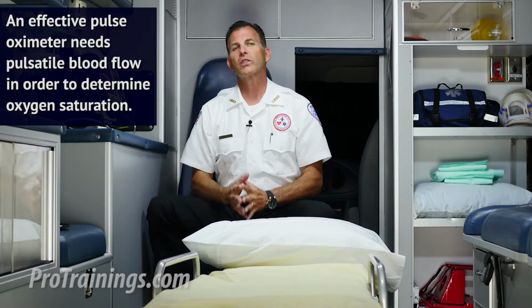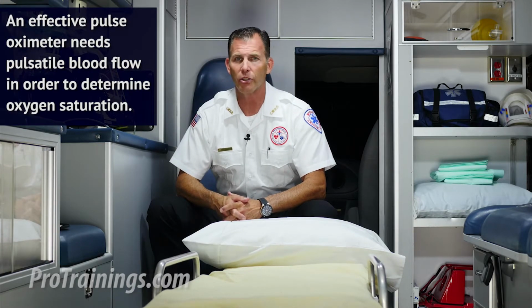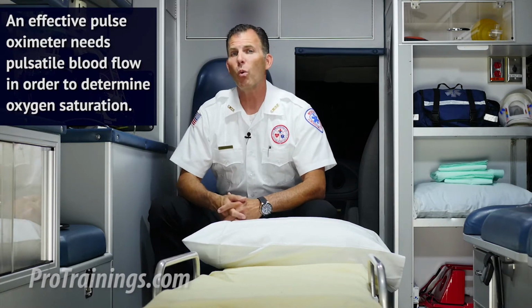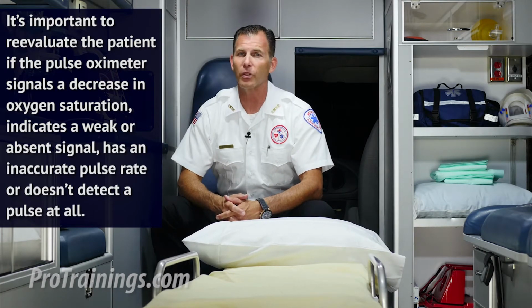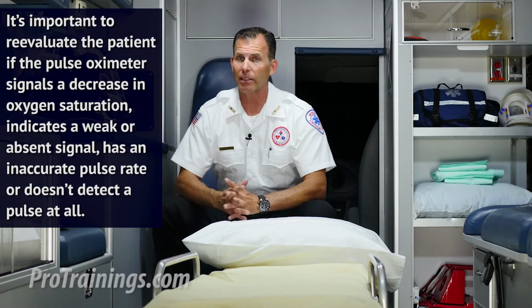An effective pulse oximeter needs pulsatile blood flow in order to determine oxygen saturation. A pulse ox will display an inaccurate reading unless the pulse rate matches the ECG monitor. And even then, we should be watching and monitoring other ways to determine the oxygenation and gas exchange of the patient. It's important to reevaluate the patient if the pulse oximeter signals a decrease in oxygen saturation, indicates a weak or absent signal, has an inaccurate pulse rate, or doesn't detect a pulse at all.